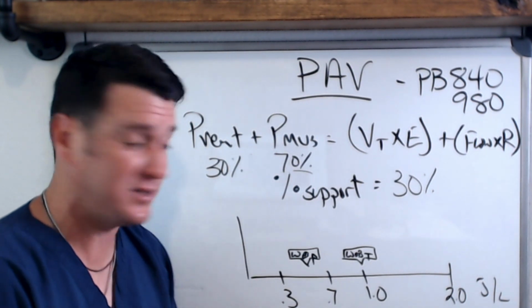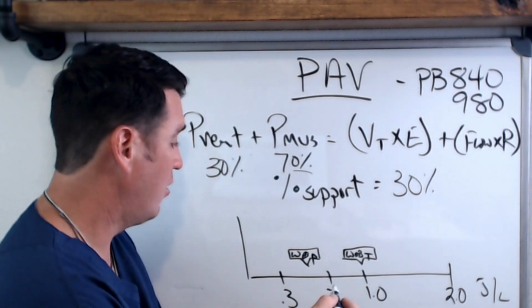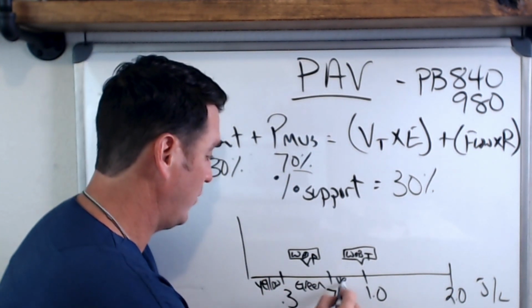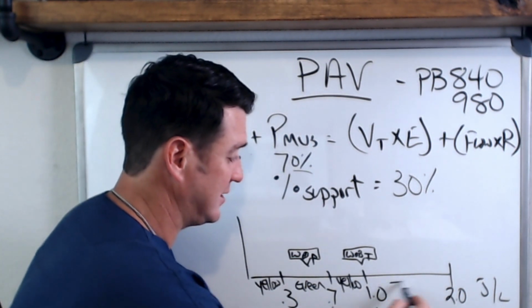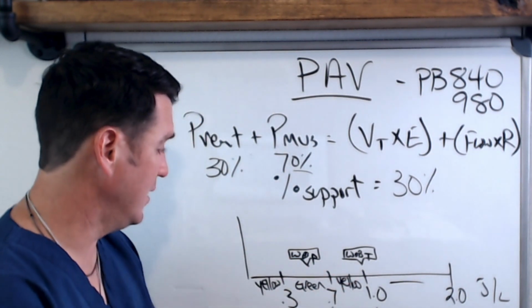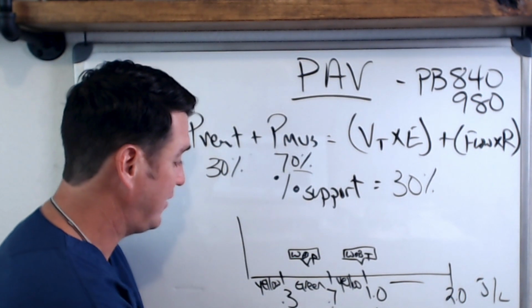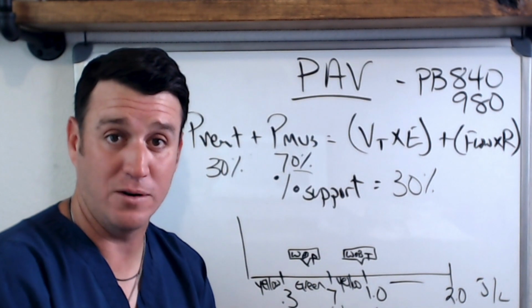If you've worked with it, then you're familiar with this, and you may have been asking yourself, wait a second, what do these tell me? Okay, so this zone right here is a green zone. These 2 zones, less than 0.3 or between 0.7 and 1, are yellow zones. And then this, I don't even remember. It's not a red zone. It's just not green or yellow, okay? But ideally, what you're looking for is for your work of breathing on your patient's side to be in this 0.3 to 0.7 zone. And this is a good sign, okay?